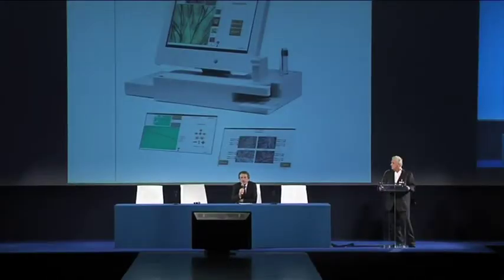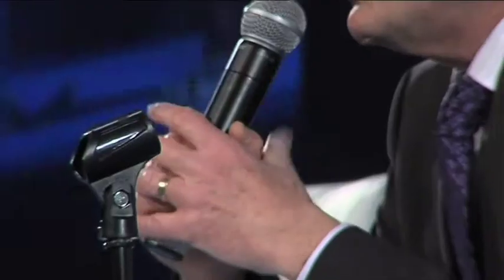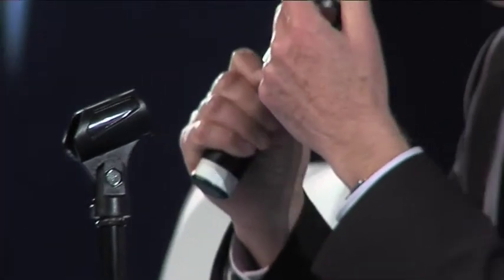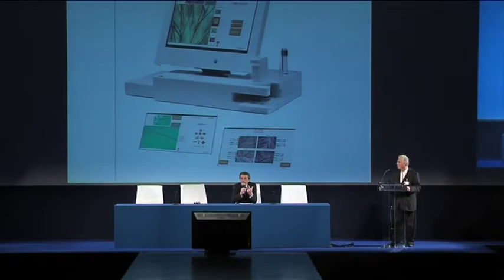And this is new. The creation of this software allows the client to understand why, to understand how they can remedy this hair loss, and it will also allow them to know how long the treatment will last. The important thing is that this will allow monitoring. This monitoring will be done through comparing the results through sketches and photographs which are taken all the way through the different parts of the treatment.